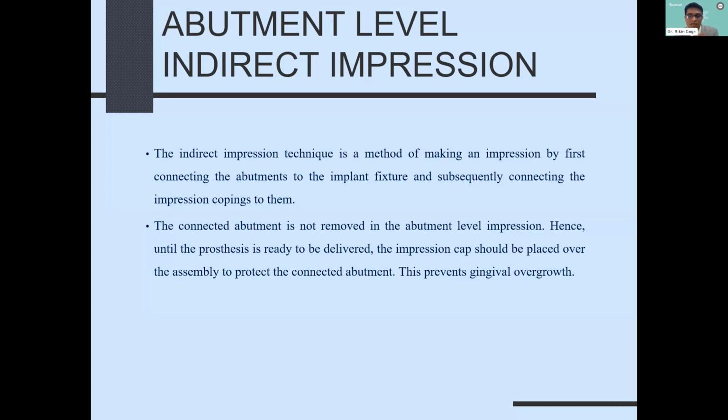You know that the tissue type is thin, and you can directly engage an abutment into your implant fixture, adjust the height of the stock abutment that is available by the company, and you block the access hole. Take the regular impression that you would do for normal crown and bridge, and once that is done, you put a comfort cap onto your abutment so that the patient does not end up damaging his tongue or lip or cheek during the time the prosthesis is being fabricated.